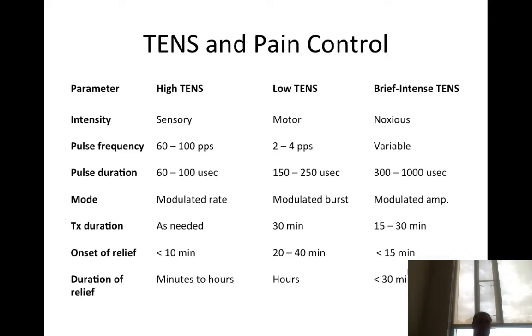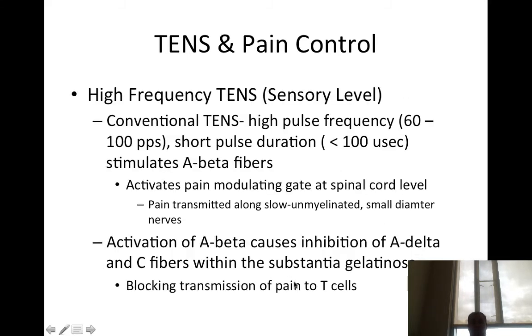Crazy, right? We see stim being used all the time in physical therapy and athletic training. But look, is it really making meaningful changes to that patient's pain for days, weeks, months? No. Hours of pain relief max.